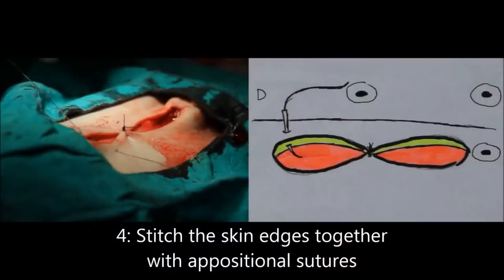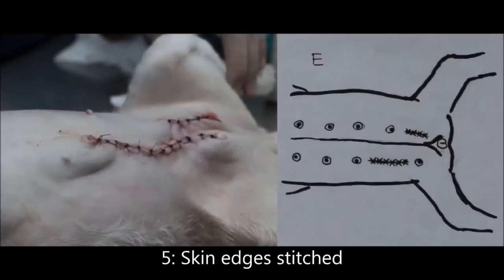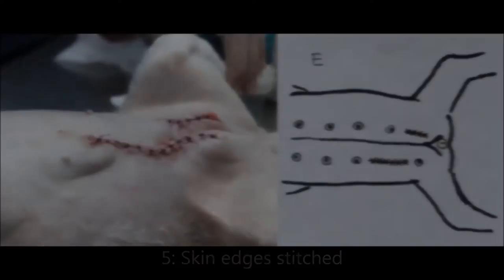Step 4: stitch the skin edges together with appositional sutures. After stitching up the incision, place bandages to compress and support the wound.